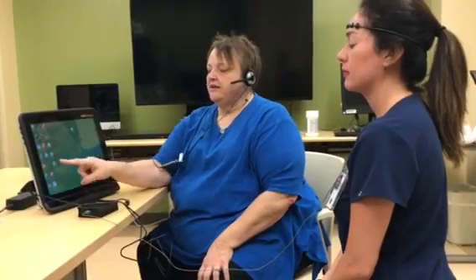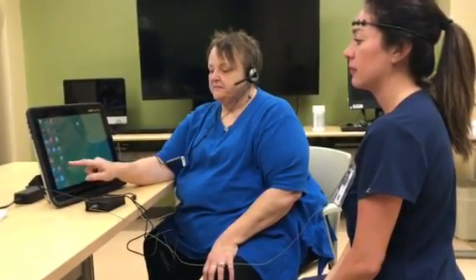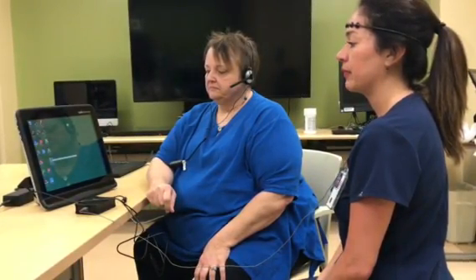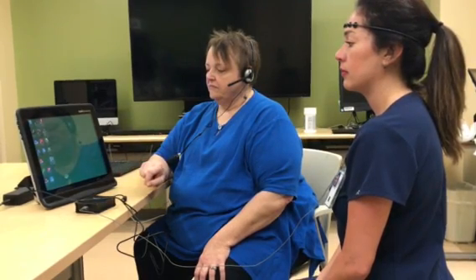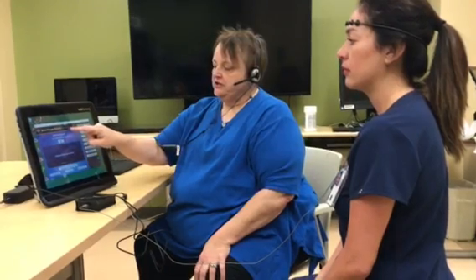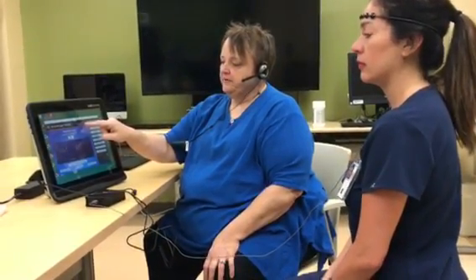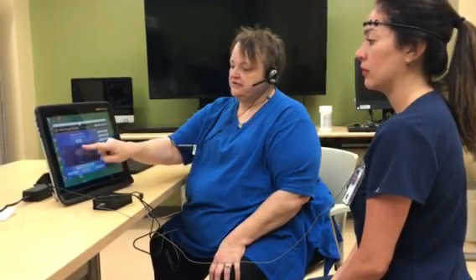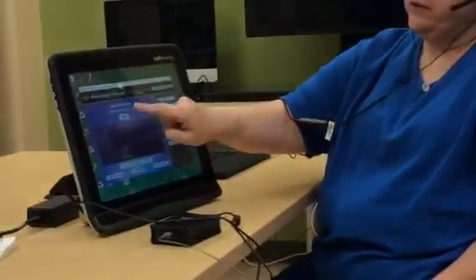On the device itself you'll see Brain Fingers Access — tap that to open it. You want to make sure the user is the person that you're setting up. It should say Quick Start Launch. You'll see the peaks and valleys of the input here, and you just press OK.